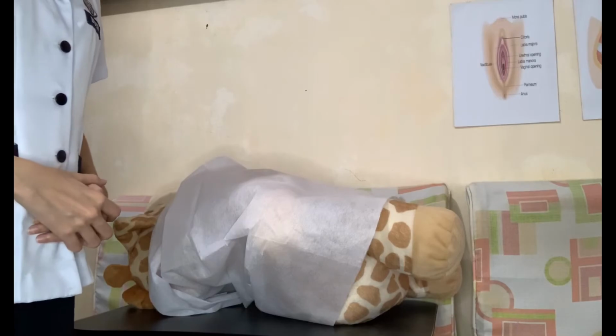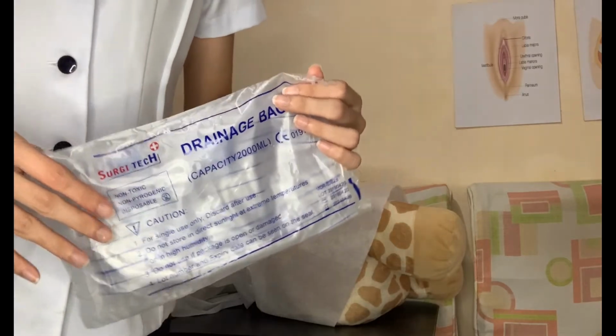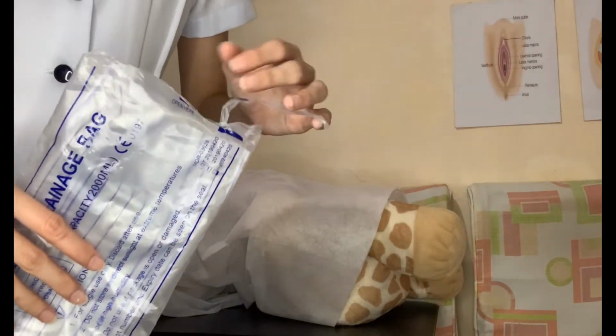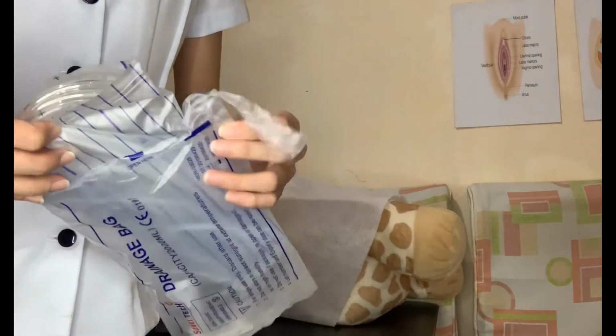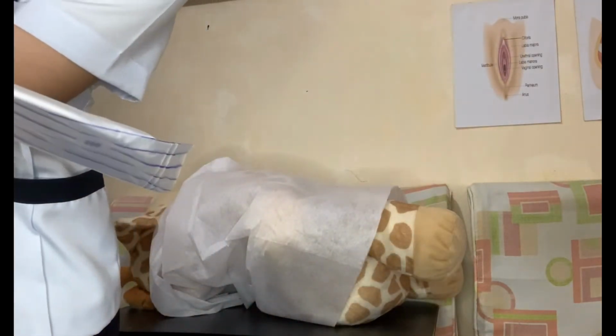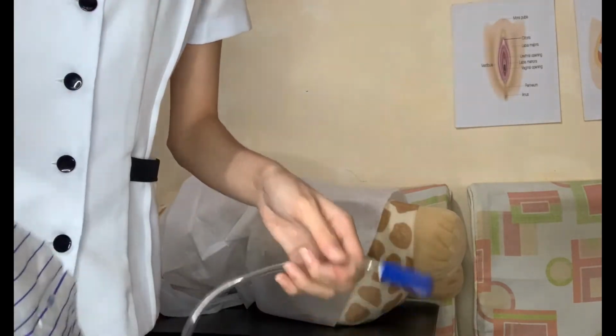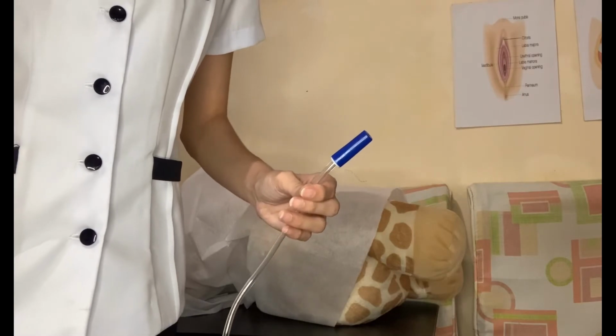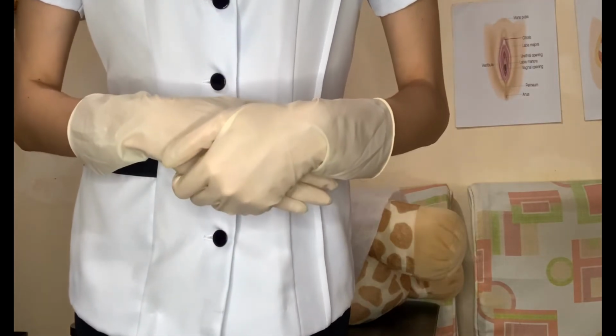So I already have established adequate lighting. If I am right-handed, I will now stand on the client's right side. If using a collecting bag and it is not contained within the catheterization kit, open the drainage package and place the end of the tubing within reach. So we have here the end of the tubing and we'll place it within reach. If agency policy permits, we must apply clean gloves.